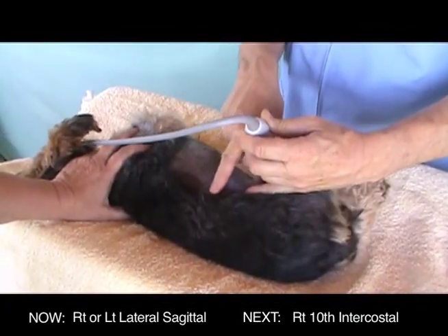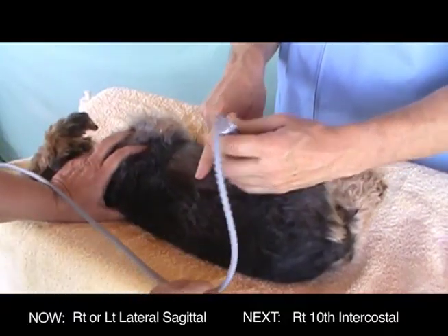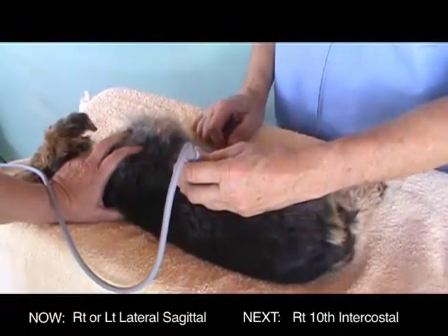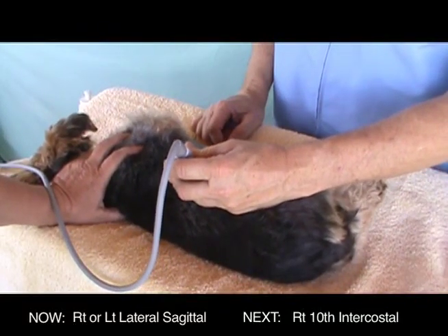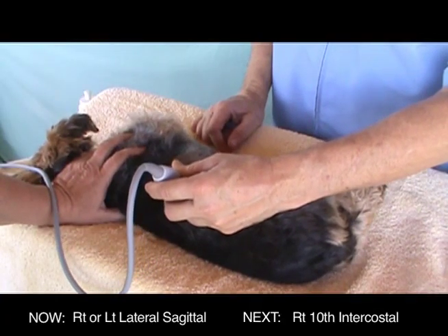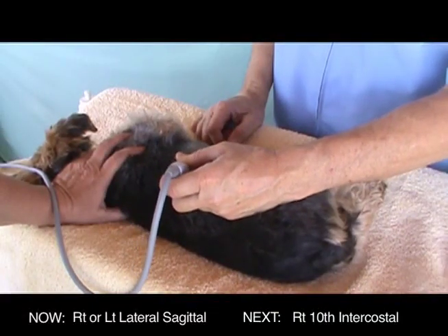On the ultrasound screen, we begin in a ventral midline sagittal position, then move the transducer to a right lateral view between the ribs. The transducer is often close to the sternum for the best view between the ribs. The transducer can be sagittal or transverse.